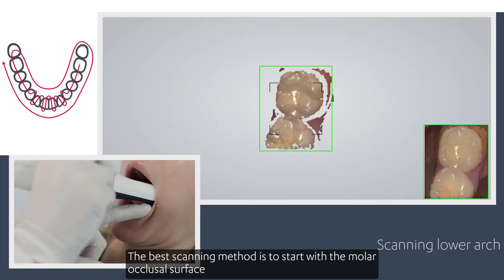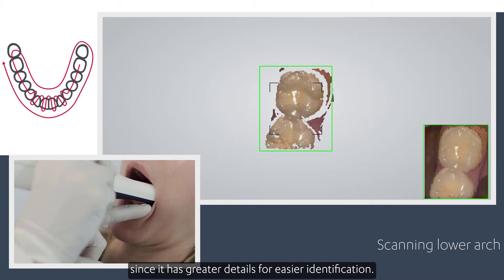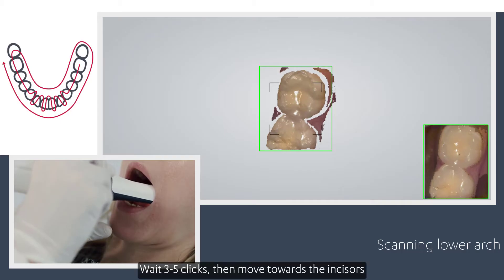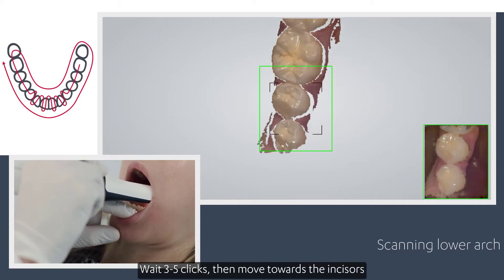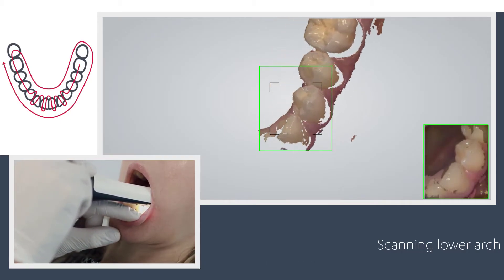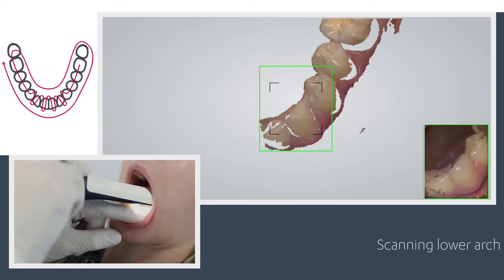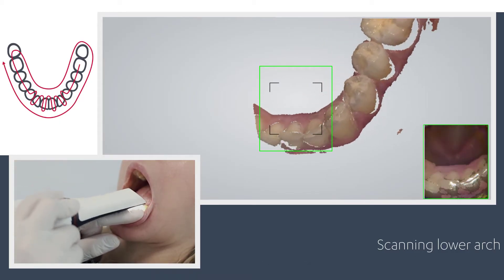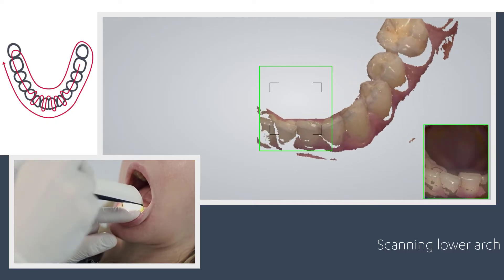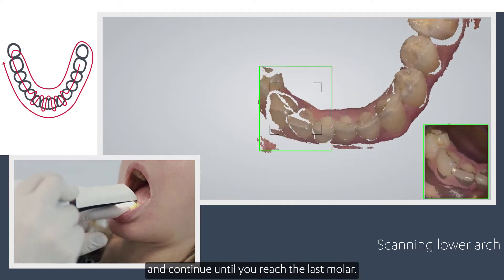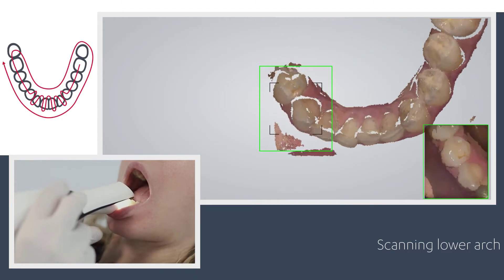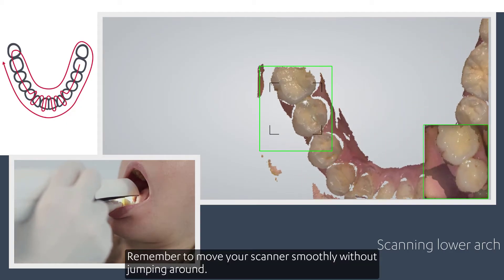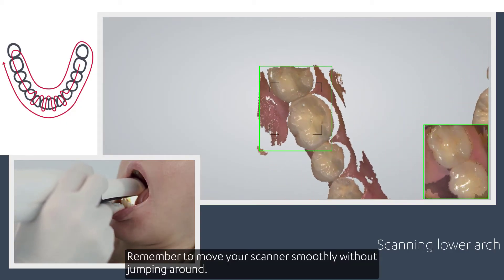The best scanning method is to start with the molar occlusal surface since it has greater details for easier identification. Wait three to five clicks then move towards the incisors. Slowly wiggle the scanner when passing the centrals and continue until you reach the last molar. Remember to move your scanner smoothly without jumping around.